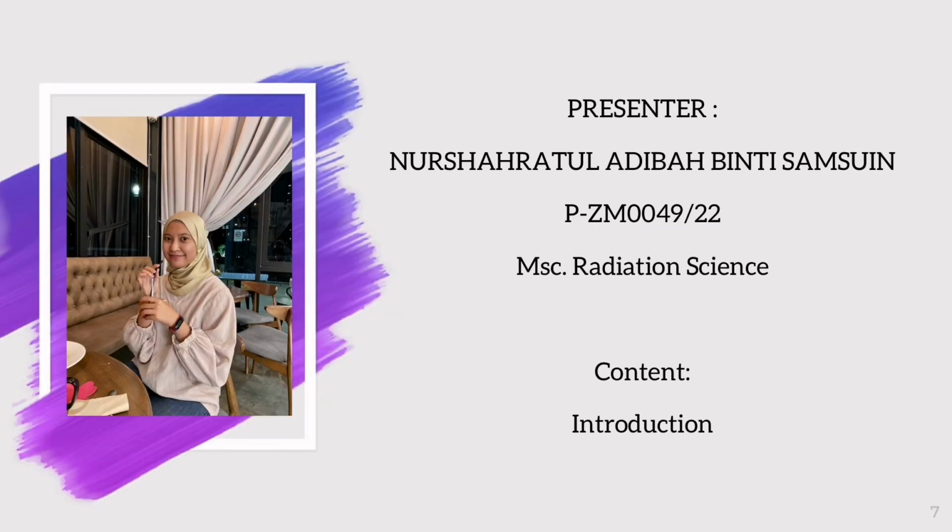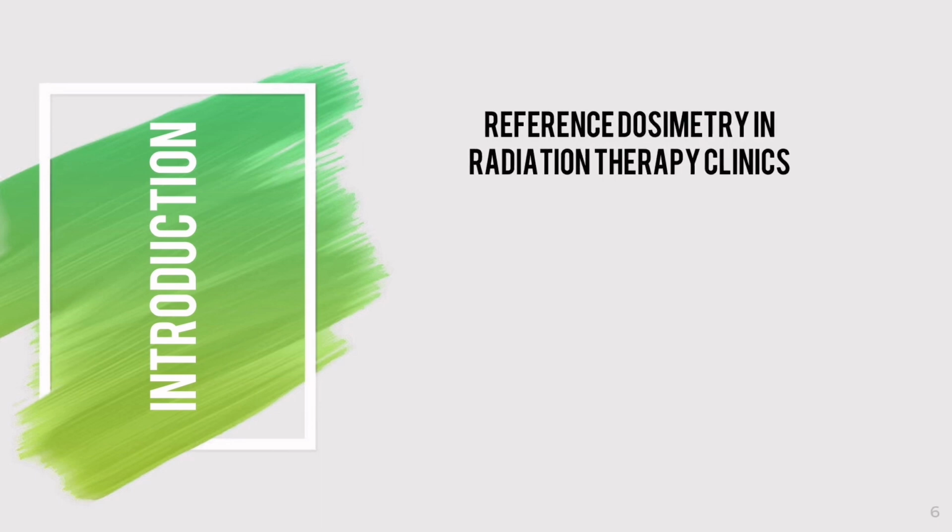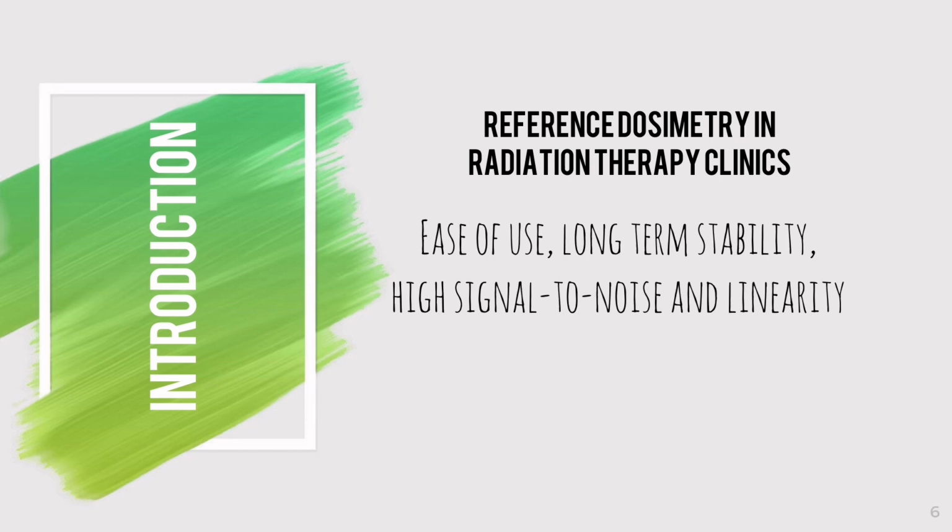Hi, my name is Nur Syaratul Adiba and I will talk about the introduction of ionization chamber dosimetry. An ionization chamber is an air-filled ionization chamber which is the workhorse for reference dosimetry in radiation therapy clinics. They have well-established characteristics such as ease of use, long-term stability, high signal-to-noise, and linearity.